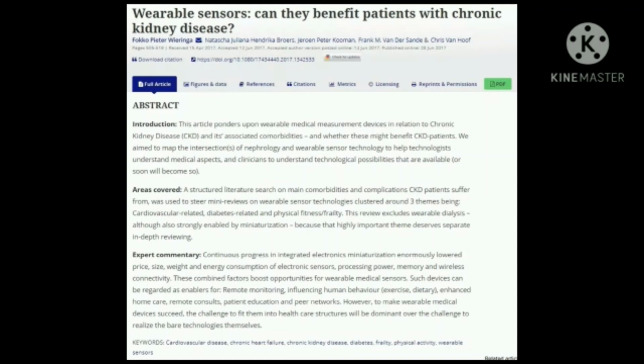In the early years of ECG Holter recording, cardiologists would have to visually scan many hours of ECG traces for abnormalities. Nowadays, Holter recordings are automatically pre-analyzed and physicians only have to judge the highlighted anomalies. It's clear that long-term recording of a plurality of various patient parameters even more needs to be pre-processed and scanned for meaningful patterns to avoid drowning clinicians in a flood of raw traces.